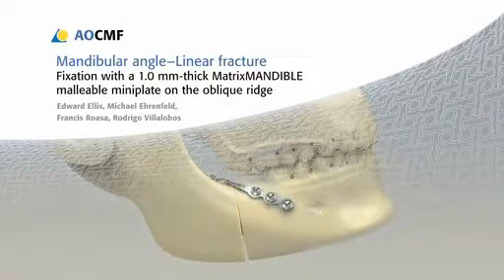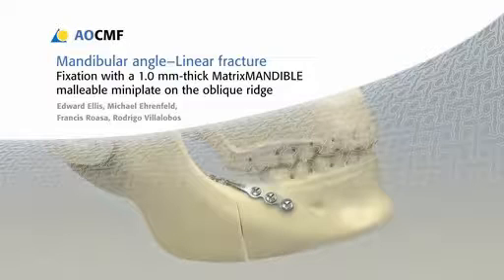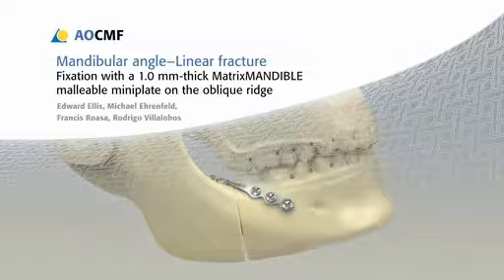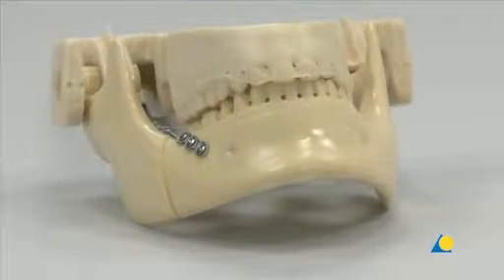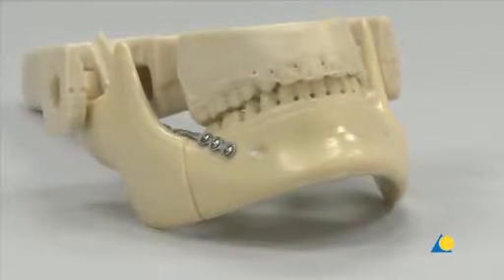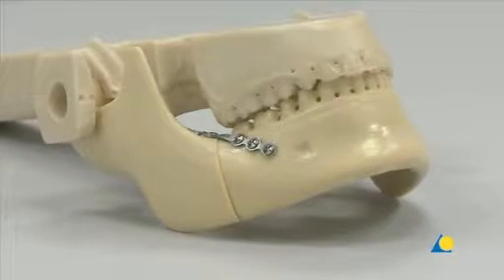In this presentation, a linear fracture of the mandibular angle is treated with a 1.0 mm thick matrix mandible malleable miniplate positioned on the oblique ridge as described by Schompe. The malleable miniplate has the same dimensions as the standard miniplate but is easier to adapt, which facilitates contouring to the complex anatomy of the mandibular angle.